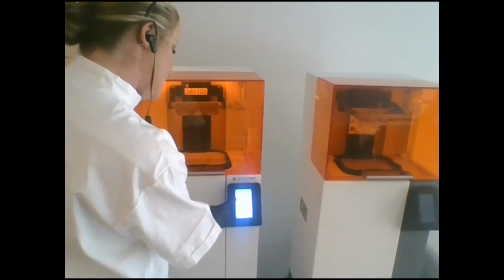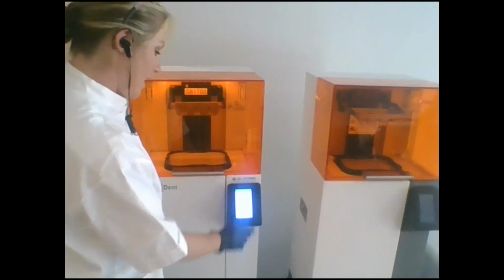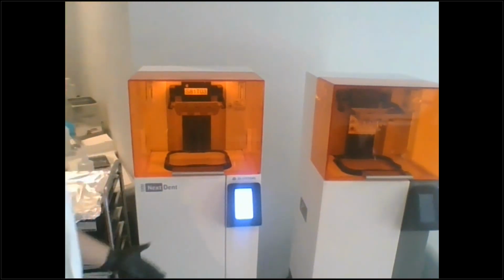And it says print platform is empty and clean. Yes, it is. Resin tray is full. Resin has been stirred. Start job. Okay, and now it'll go ahead and start the job.